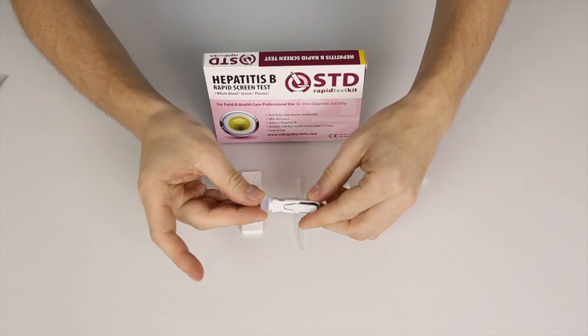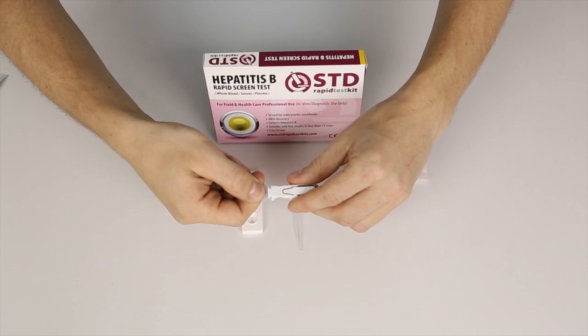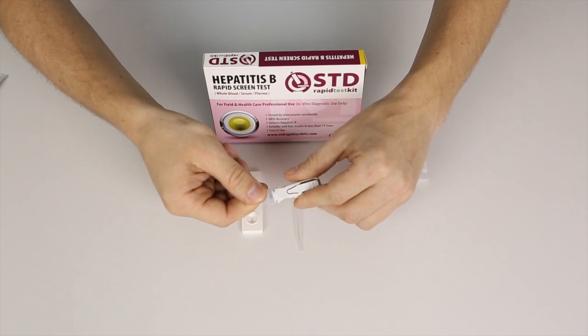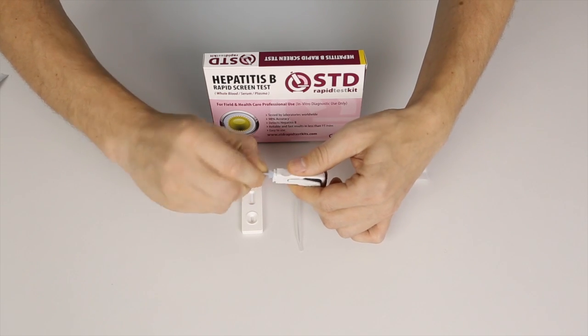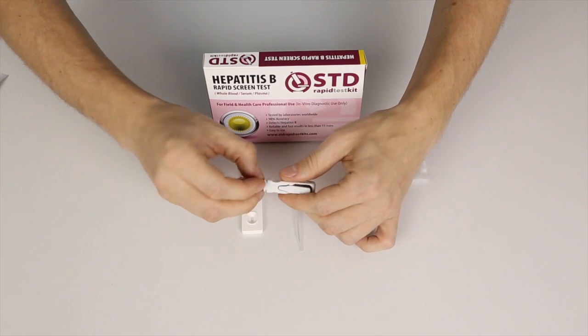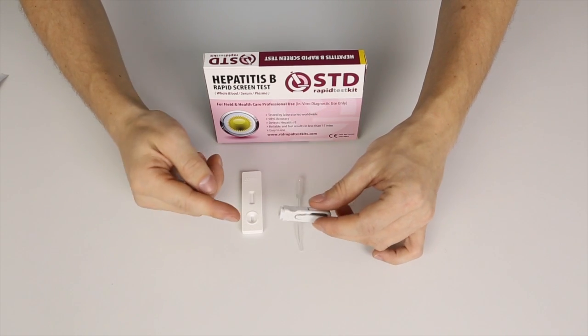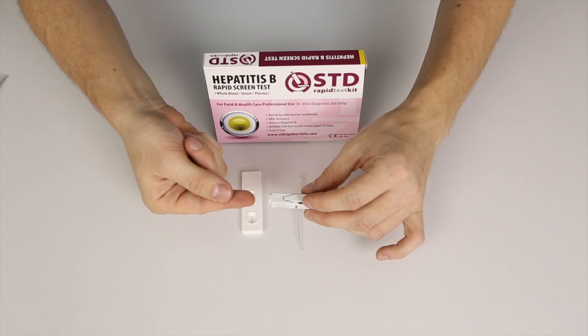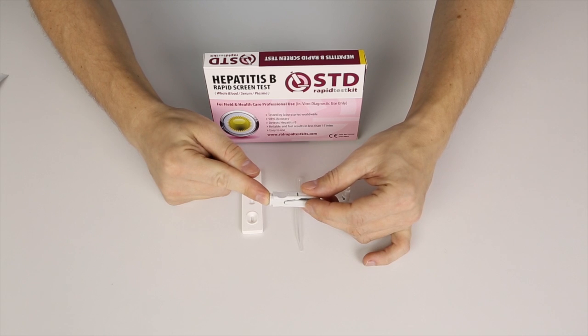Take the lancet. You push this green knob in — it might have a different colour in the test that you received. Push it in, then you twist it a couple of times, then you pull it out. The lancet is loaded and we can use it. I'm going to place this against my right fingertip and then push.